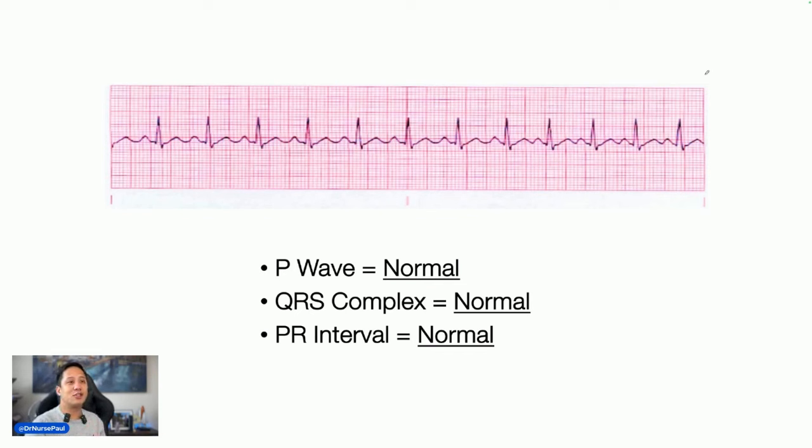But anyway, that's just being an ER nurse for me. You've got an intuition, right? Because that can cause mistakes. So anyway, I don't trust you guys, so I count it myself. It looks like 120 for me.